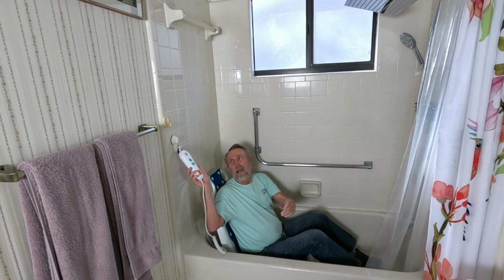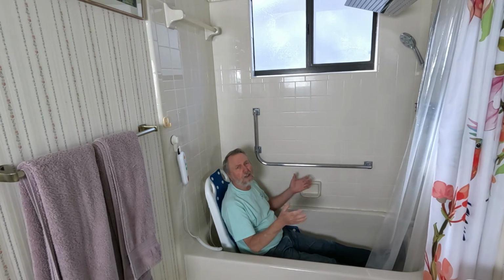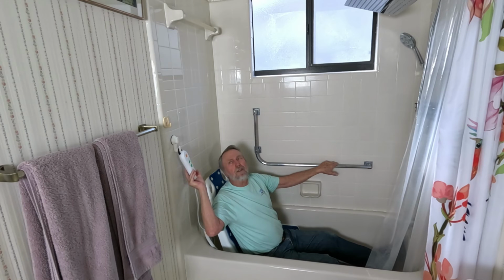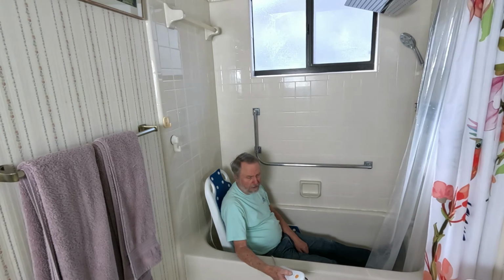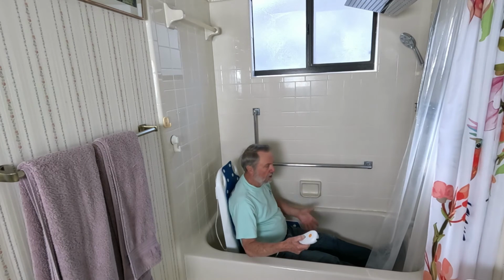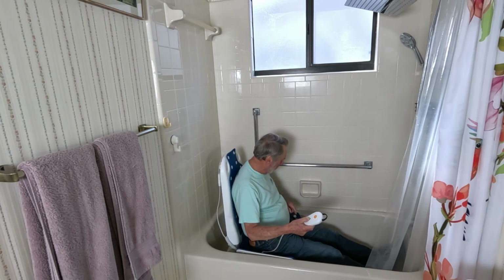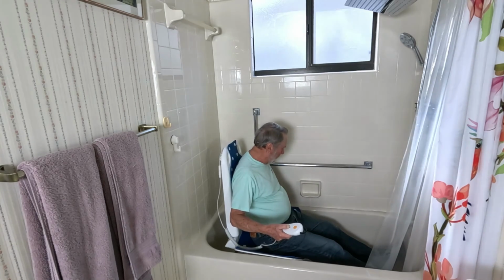And now I can hang this up, and now I can sit back and relax and enjoy my bath, soaking bath. And then when I've completed my bath, then I take the remote control, and I'm going to go up to the full height. I press and hold the up button, moves away from the wall, and up I go. Now see, this is riding right along there, and you can see if it were up underneath here, that might be an issue, but it's clearing it just fine.